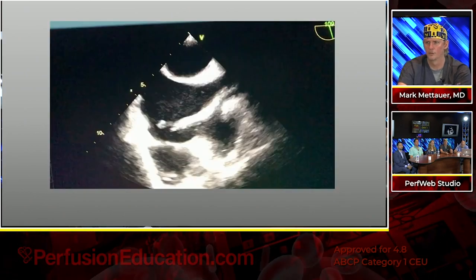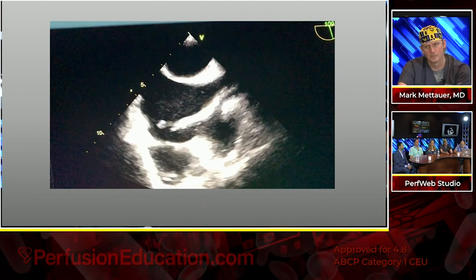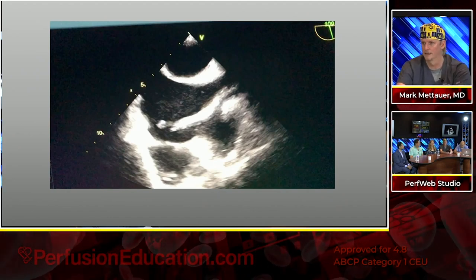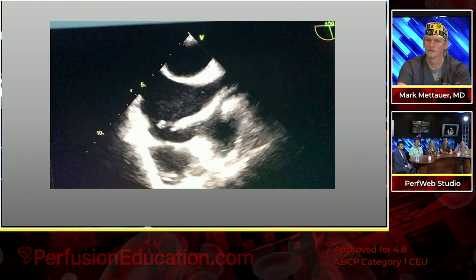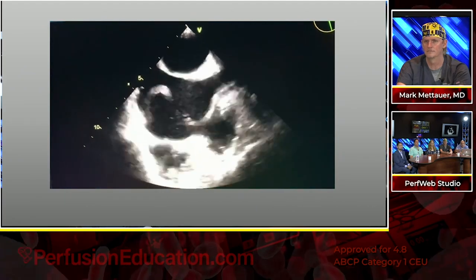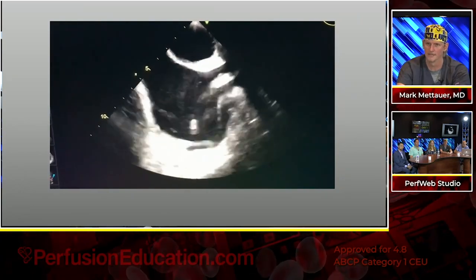And that shows that you don't want to put it too far in, which we almost did today, because we had all the lights on for filming and couldn't really see the tip of the angiovac. So quickly, this is the TEE version. And that's a video, you know. Yep, David's got me set up. Great. I don't have to think too much, which is the way I like it.